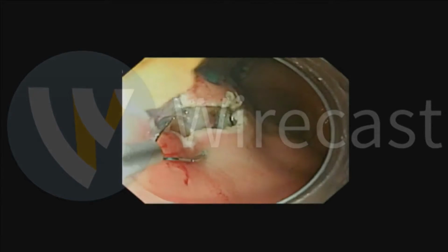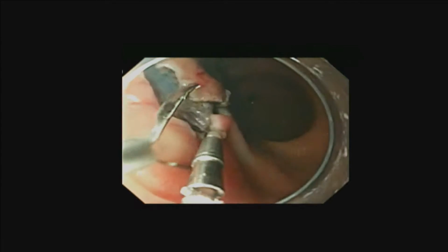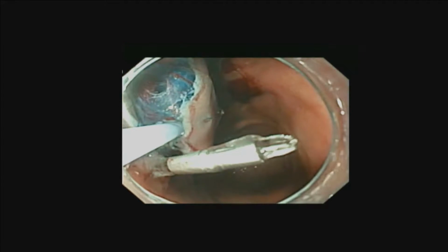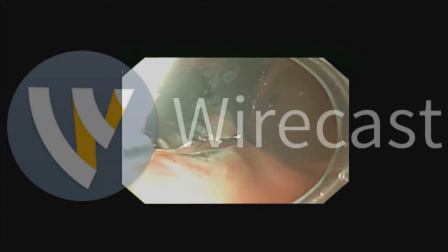Please calm down and try to check where the perforation area is and take up the closure with the clip like that, and then additional injection and additional submucosal dissection like that.